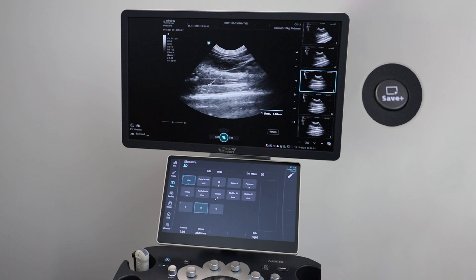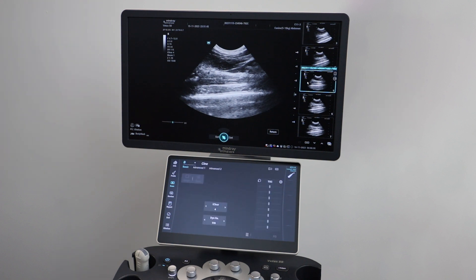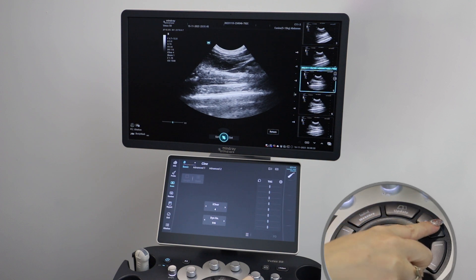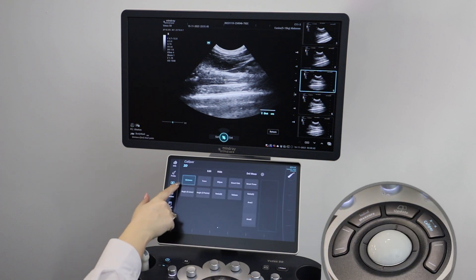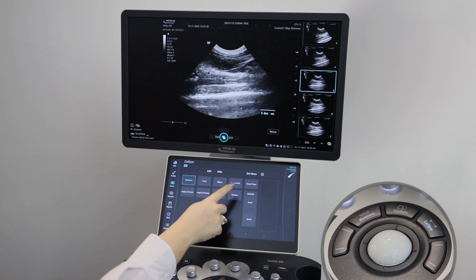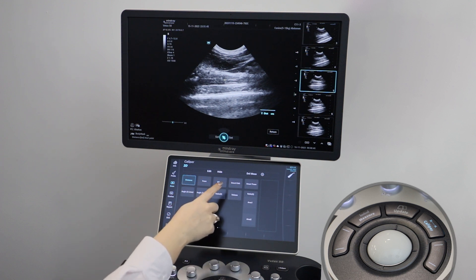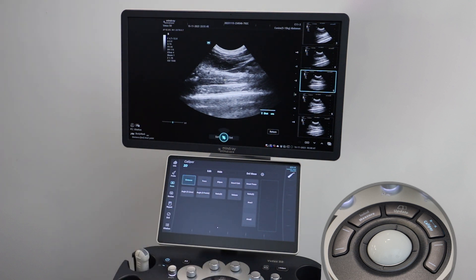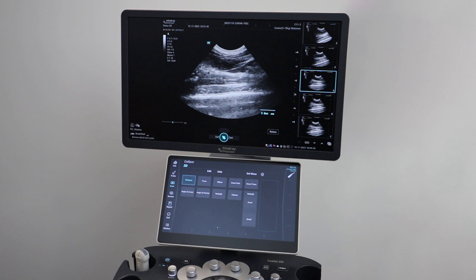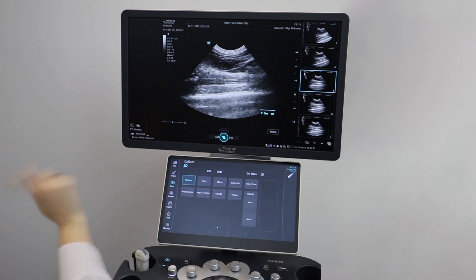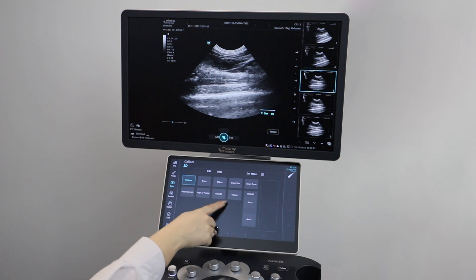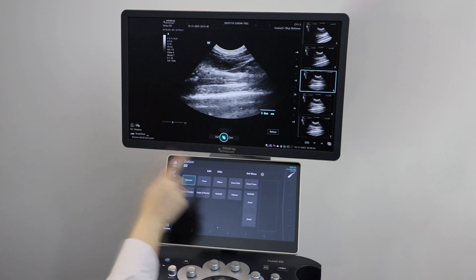To take a caliper measurement without a label — if you wanted to show a distance, trace, or volume measurement for example — use this option. You can select your option on the second screen and then again swipe right for more options. Repeat the same process to create your measurement and always remember to click save.